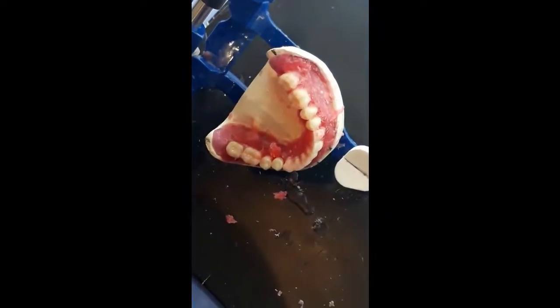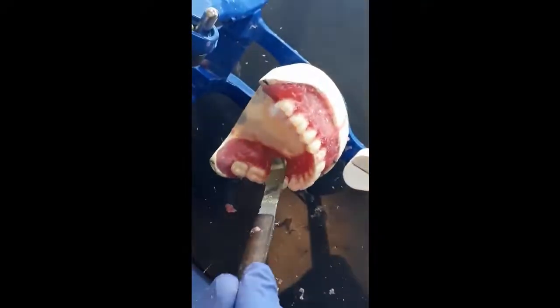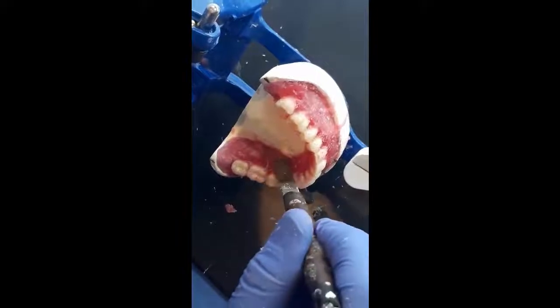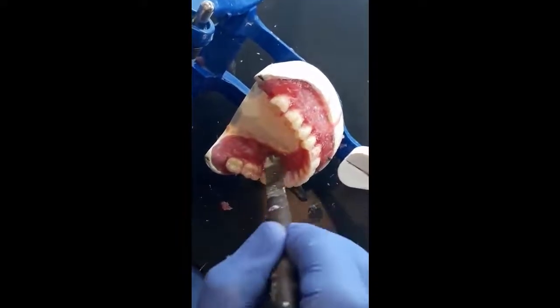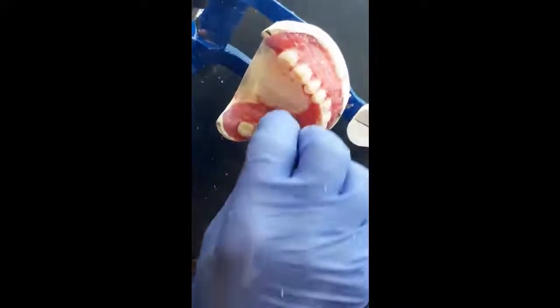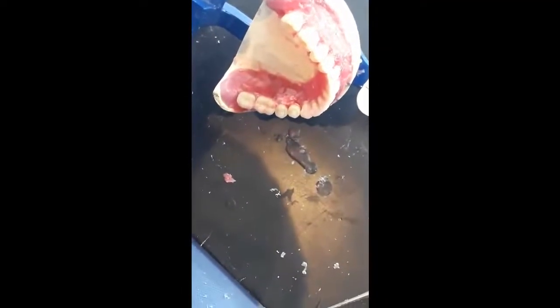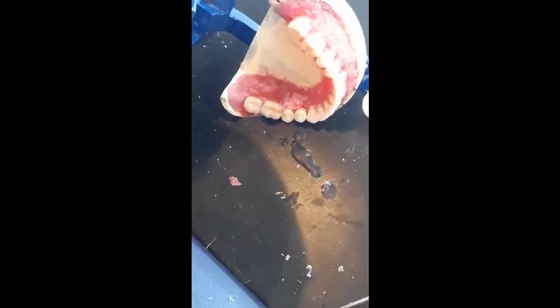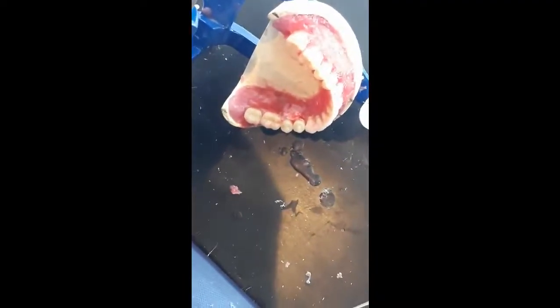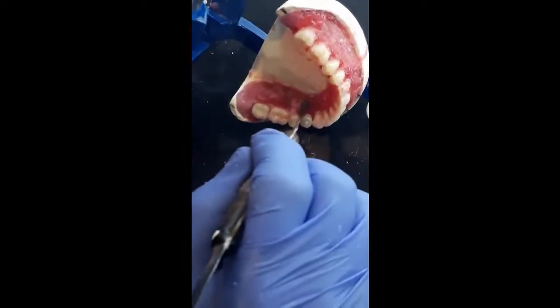And you can see that the line joining the central fossa of the teeth is a straight line, and it matches or coincides with the line indicating the crest of the ridge of the mandible.